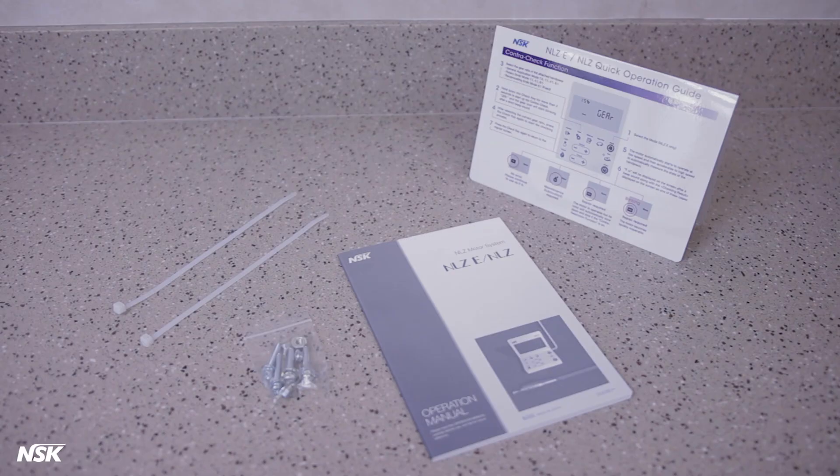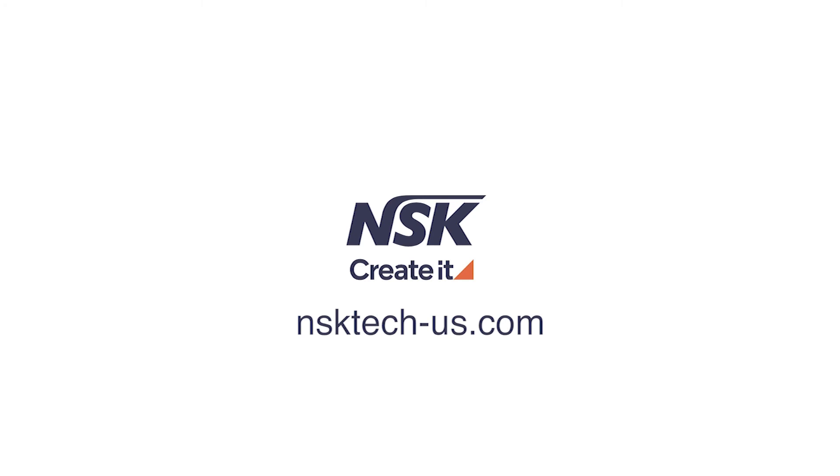Also included are mounting screws, nuts, zip ties, and the operation manual. If you have any further questions, please visit our support site, nsktech-us.com.